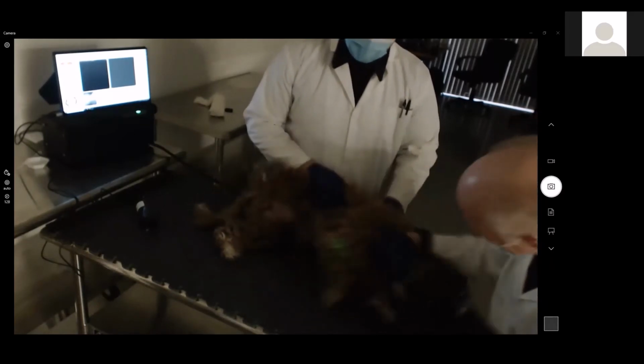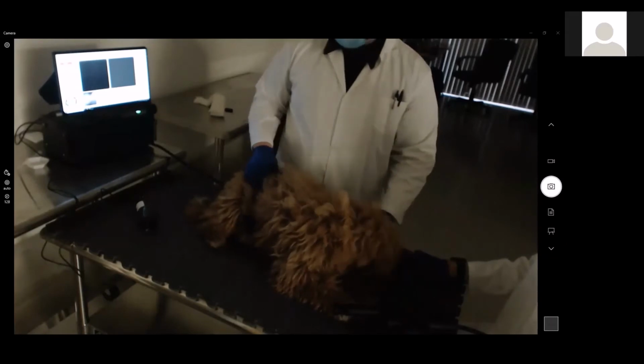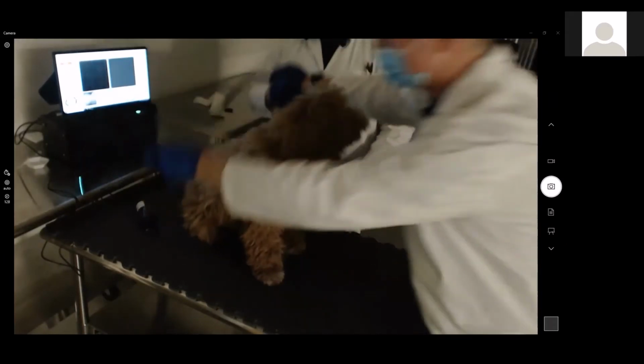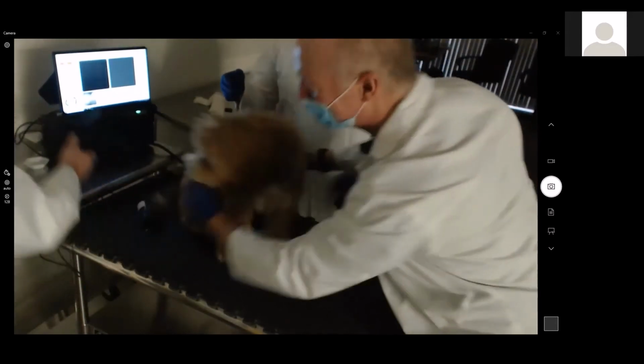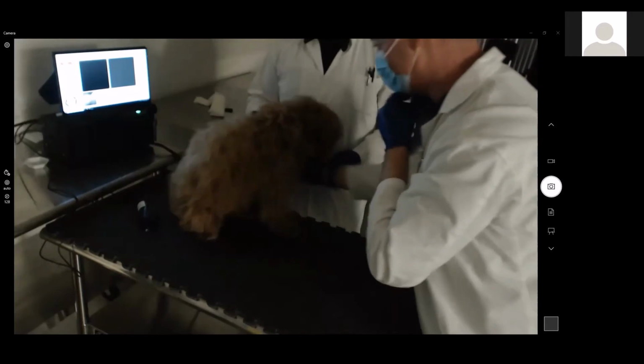Oh boy. Okay. Folks, I think I'm going to try to call it quits. I apologize. I'm not successful in showing you how to get the retina and the cornea. That's not what I wanted to do. But sometimes we're just going to have to drop back and punt.